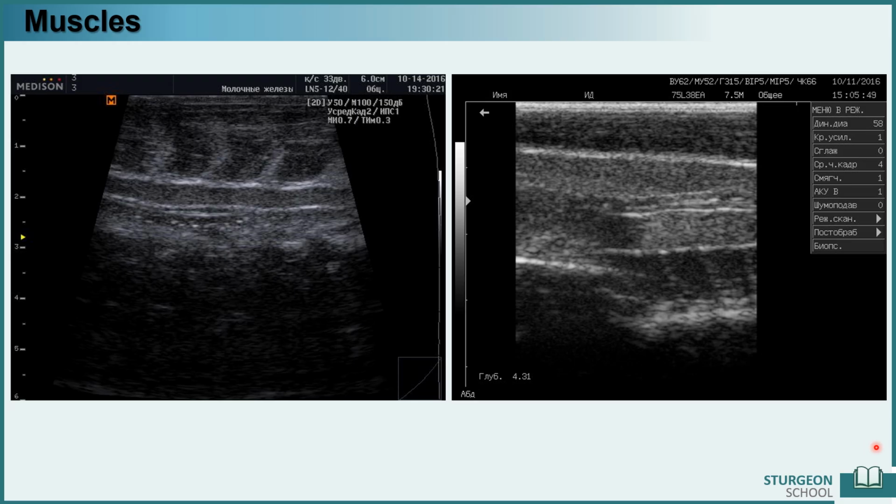Myomeres of muscles, depending on both the species and peculiarities of fish, as well as on the location and angle of the transducer, can either be clearly pronounced or visualized by a solid band of different shades of gray, but in any case, the upper part of the image on the sonogram, located above the bright enough thick light line, is the muscle. On the left sonogram we see their characteristic, visually recognizable, muscle pattern. On the right sonogram in the upper part it is just a stripe, and in the lower part of the gonad we already see the division of the musculature into segments.